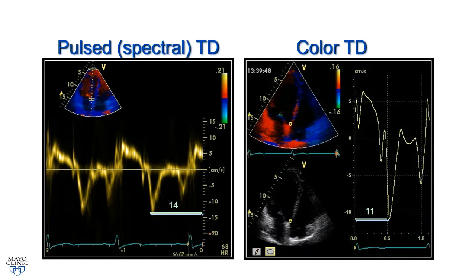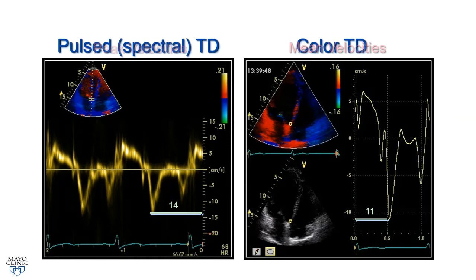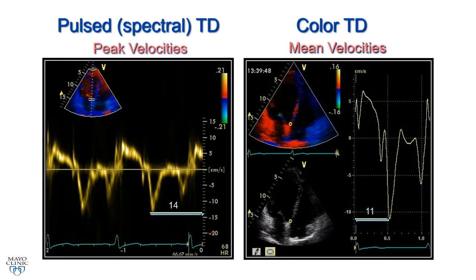There are different methods to obtain a derived parameter such as the early diastolic mitral annular E prime velocity. On the left, using pulse wave tissue Doppler, we get an E prime of 14 cm/s. On the right, same patient using color tissue Doppler, we get 11 cm/s. That makes sense because with color Doppler we measure mean velocities, while with pulse wave tissue Doppler we measure peak velocities. When applying E prime to diastolic function guidelines, we use pulse wave tissue Doppler.